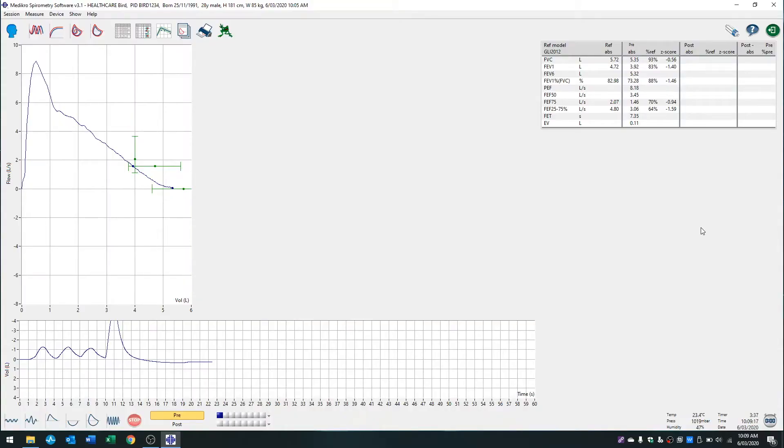Hi, this is a Bird Healthcare video. In this video we're going to explain how to perform a spirometry test within the Medikro spirometry software.